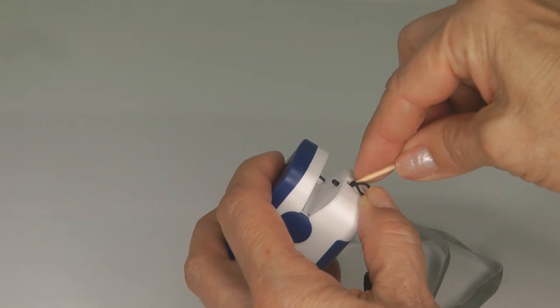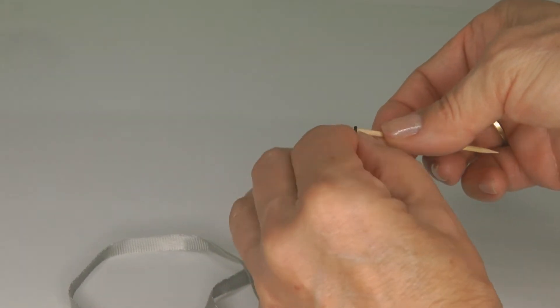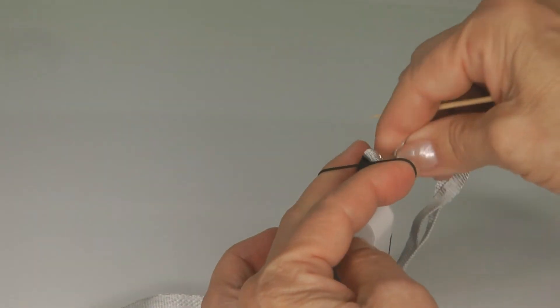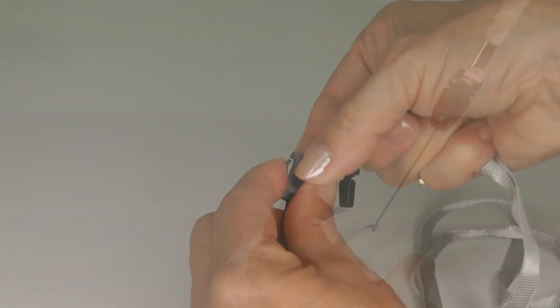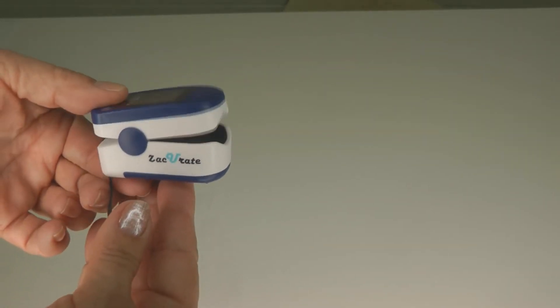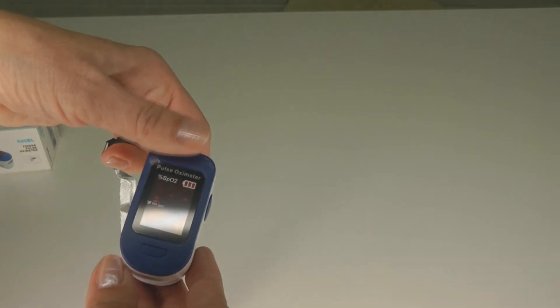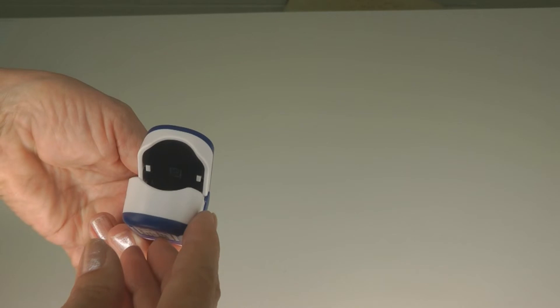I had a little trouble getting it through, so I pushed it through with a toothpick. The lanyard is a nice addition if you want to use it for sports. Press on the back and insert your finger. If you look inside, you can see a little light — that light passes through your fingertip and measures the amount of oxygen saturation in your blood supply.